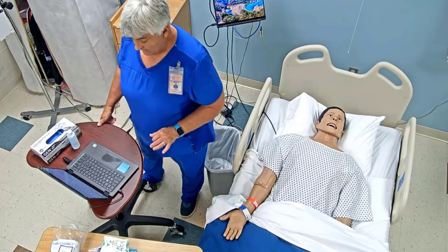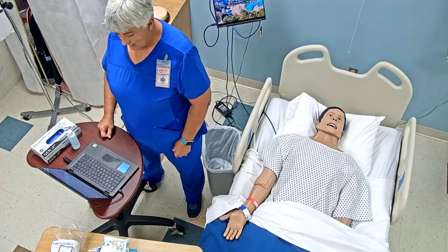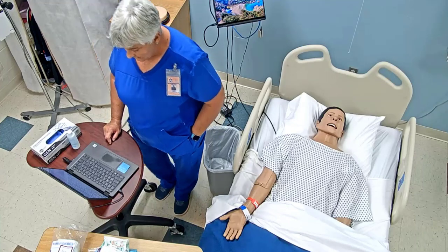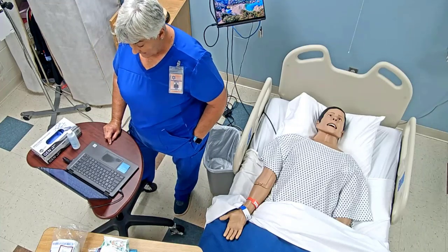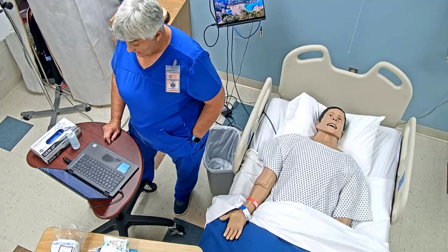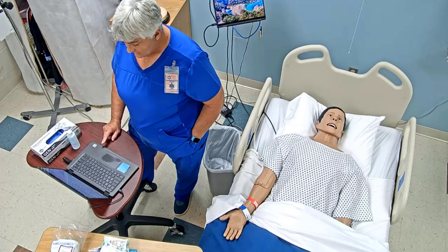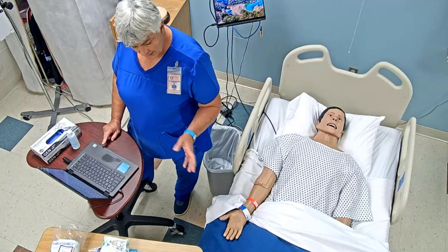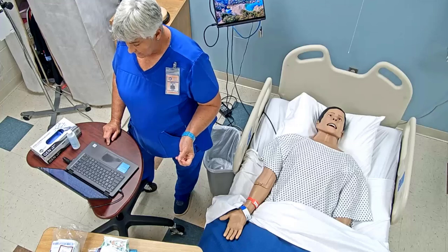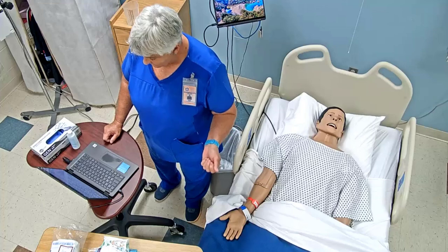So what I'm going to do first is go to the nurse's station and open up my chart. I'm going to be looking at my patient, Brad Taylor, date of birth 4/24/1991. Dr. Potter is his physician. He is not allergic to any kind of medications. He's having difficulty with urinating, but also we need to get a specimen, and to get a sterile specimen, we're going to go ahead and do a straight cath.